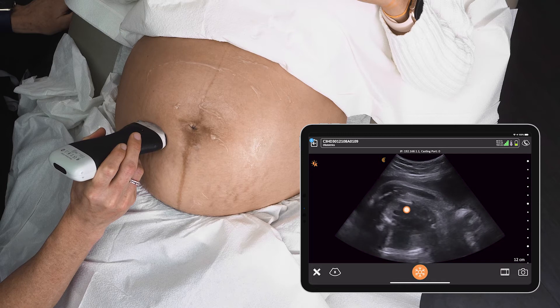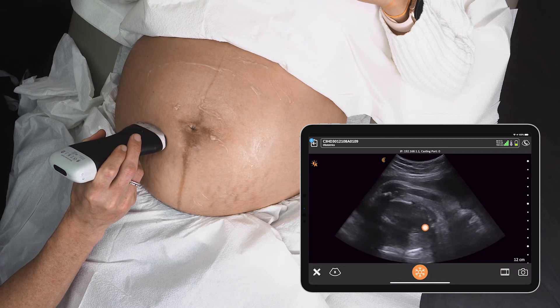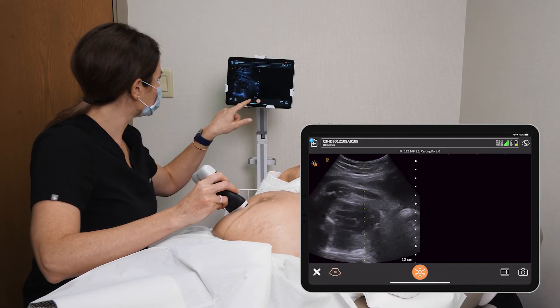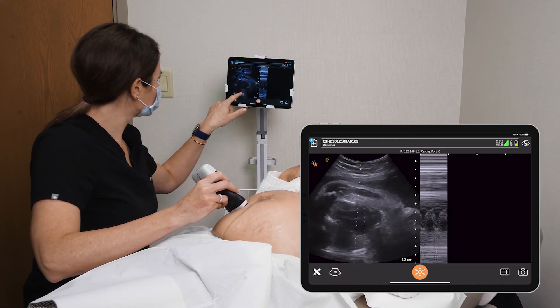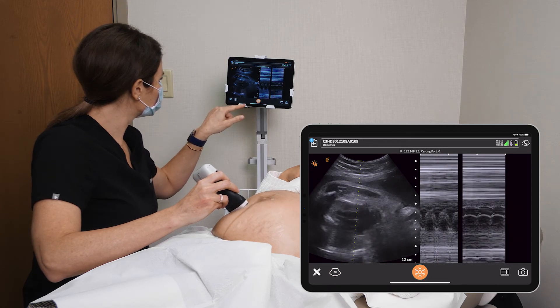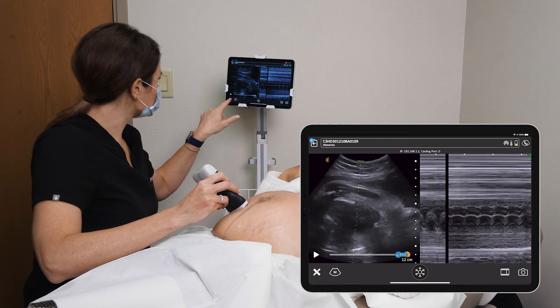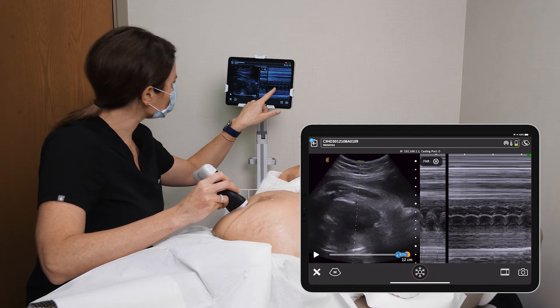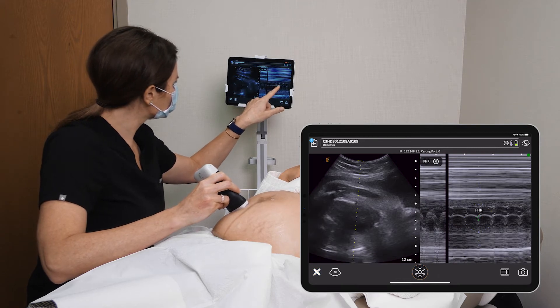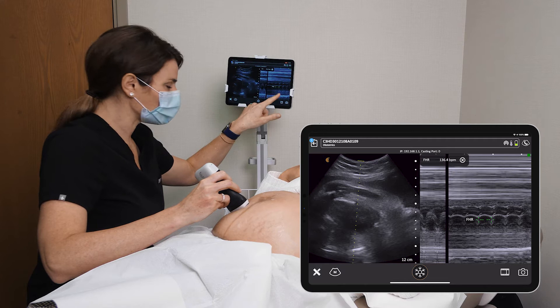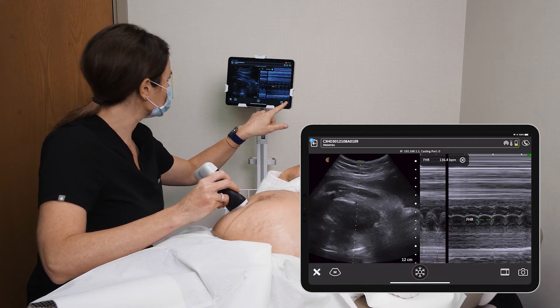Baby's heart is beating there. You can get a heart rate with our M-mode. Great. Now we just use the measurement tool to get the fetal heart rate — it's about 135 beats per minute. That's normal.